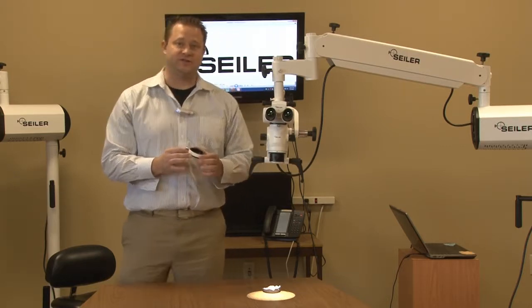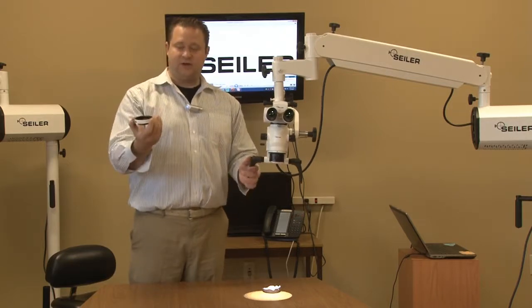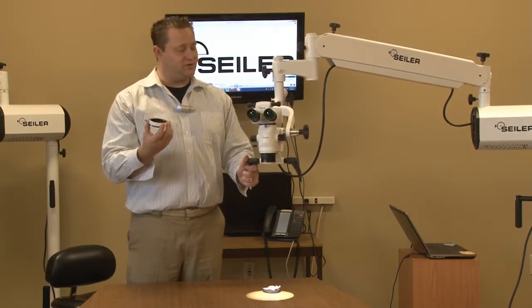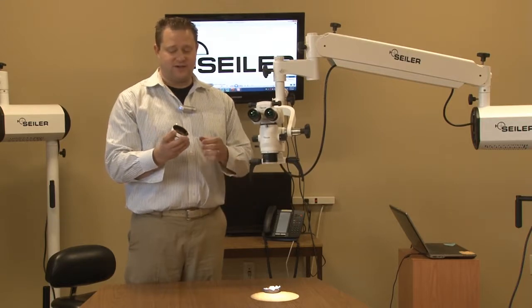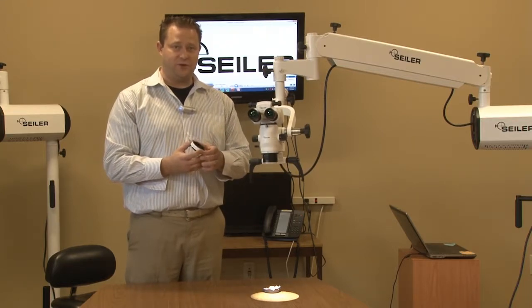Hi, I'm Dan Carlson, Division Manager of Seiler's Medical Division. Today I'm going to talk a little bit about our laser filter. Our laser filter is pretty unique in the sense that it covers from 780 nanometers all the way to 2940 nanometers.